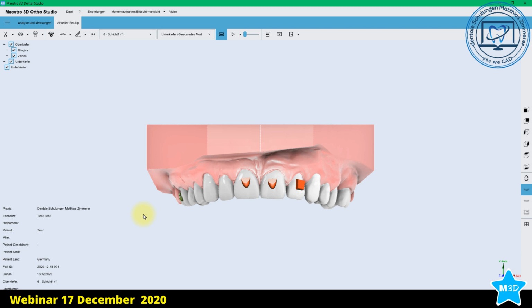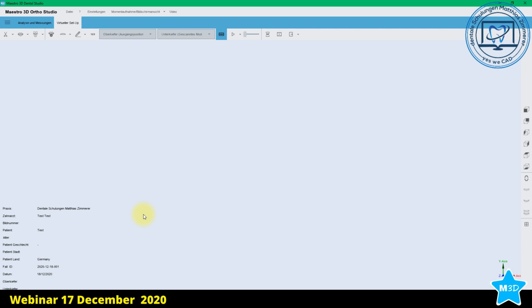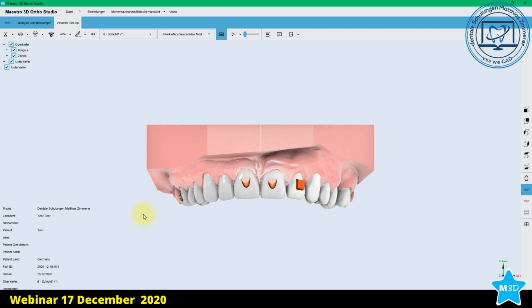And like you have seen, if there are green values, you have to make the values higher. After you have done this, because the software will tell you this is not possible with the standard values you have chosen, you can decide to make a higher movement on the teeth. And if you want to do this, it's possible to go this way with lower. If you have made the models, then you will see the movement of the teeth.